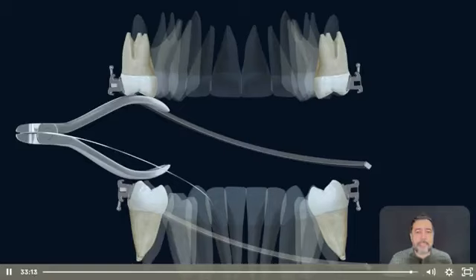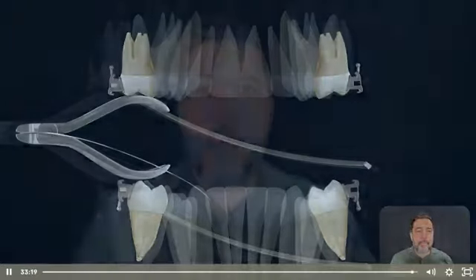So guys, this is what we wanted to show in this part of the class. What I really wanted to show to you in this part is this clinical aspect of the biomechanics with torque. We must at all times understand the relationship between the real and the relative torque.